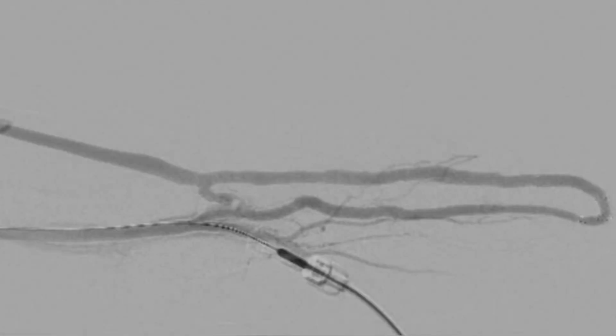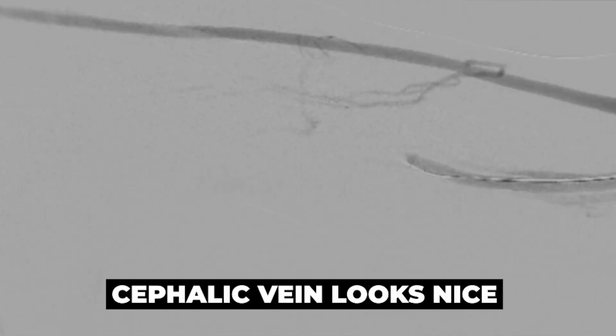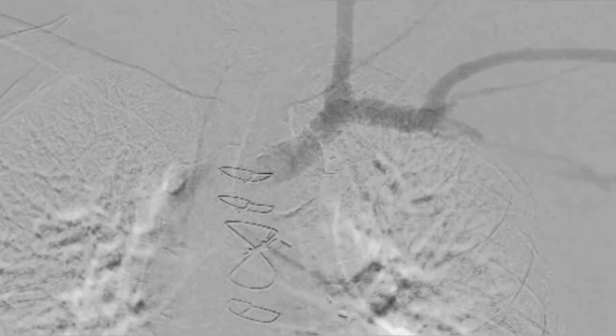The patient started using the fistula 2 weeks after that and came back for follow-up in a few weeks, and it looks great. The fistula is maturing. He's been using the fistula now for a few months. The cephalic vein looks nice and the central veins look nice. So nothing else needed to be done.